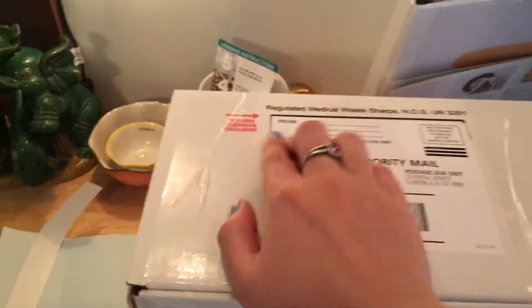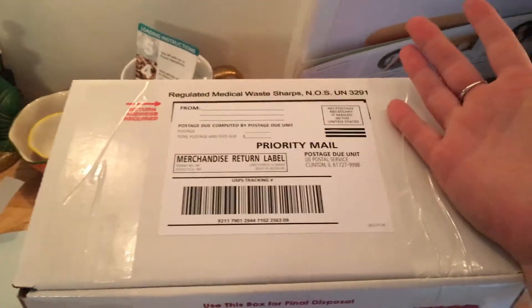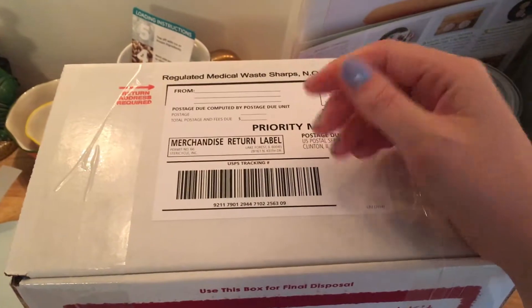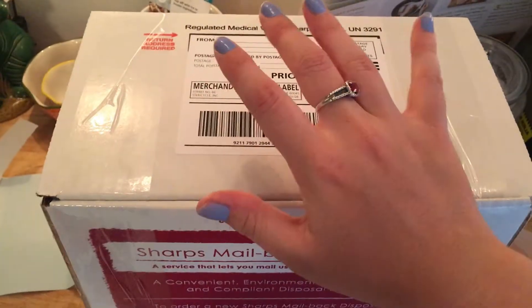It's all ready to go — all taped up. I'm going to put my personal information on here, and all I have to do is drop it off at the post office. They will send you a letter in the mail when they've incinerated it, which basically just means they have disposed of the sharps safely in a facility.